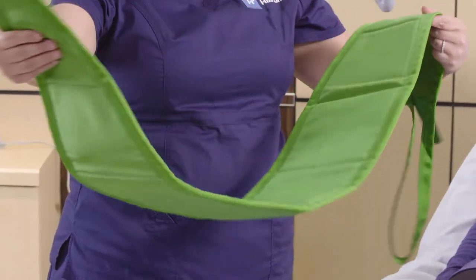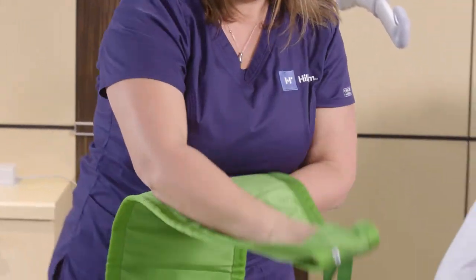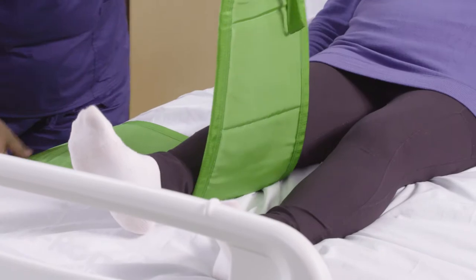This is the Multi-Strap Wide. The Multi-Strap Wide is utilized by taking this pocket here and placing your hand in there. Once we get our hand in place, we're going to go ahead and take the Multi-Strap, press against the mattress, slide it under one leg and bring it through.